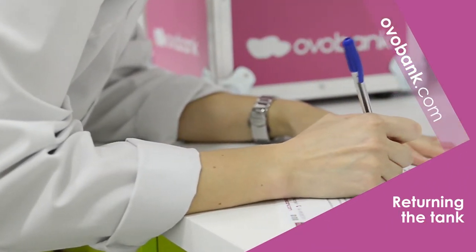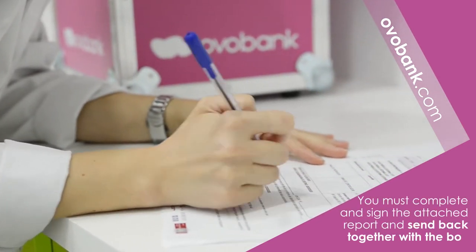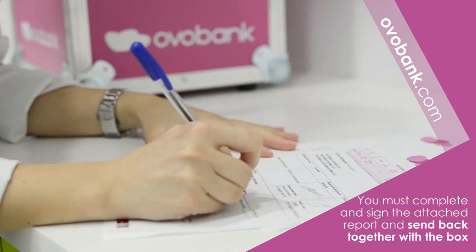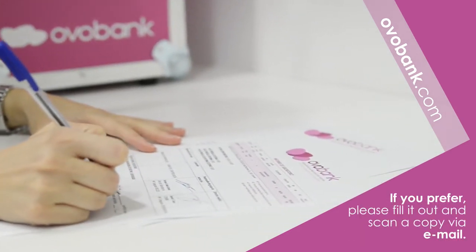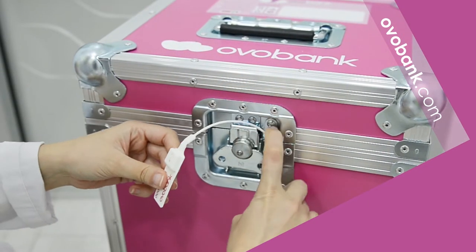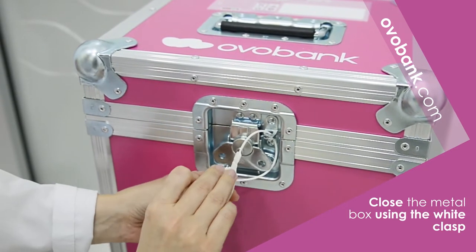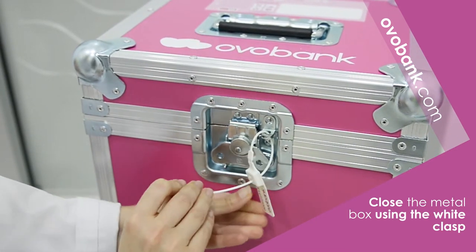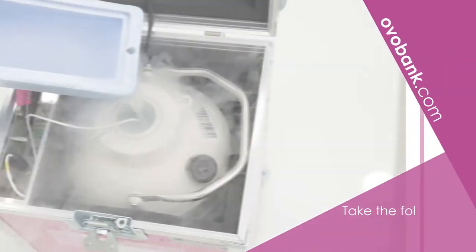Continue with the tank return process by reviewing the documentation attached to the shipment, where you will find two reports. You must complete and sign one of them, sending it back to our bank either in the box or scanned by email. To return the container, close the metal box using the white clasp inside the box before commencing tank return.